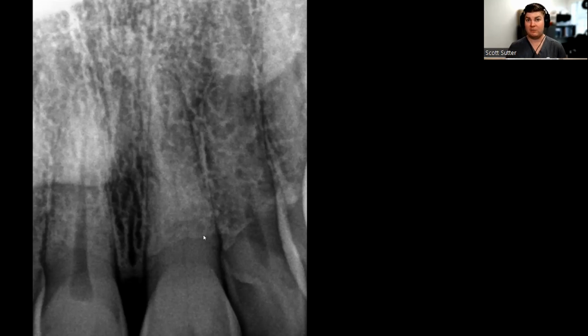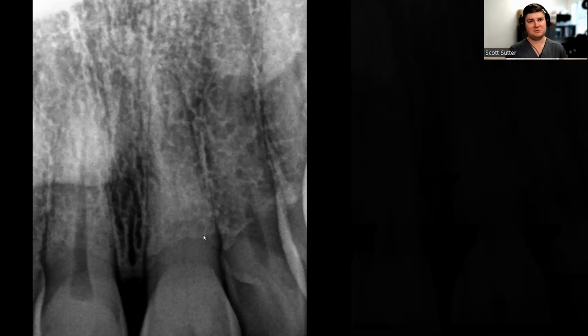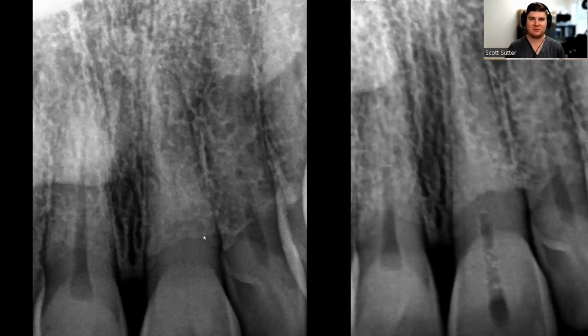When you look at the cone beam, there's nothing. So I would have to pretty much drill 21 millimeters down to create a canal to bleach her tooth, which leads me to: sometimes you can just bleach the tooth and not do the root canal. So this is the case. This is a check film I took as I was accessing to make sure we were right in line and everything looked good, and started to bleach the case.